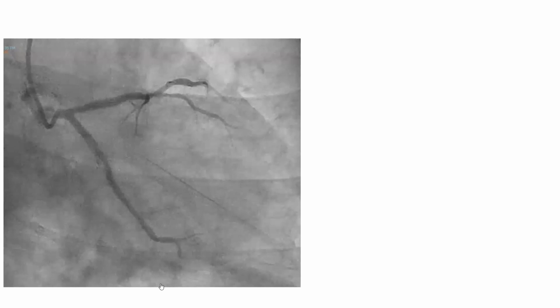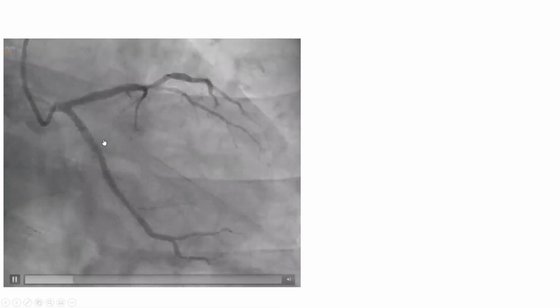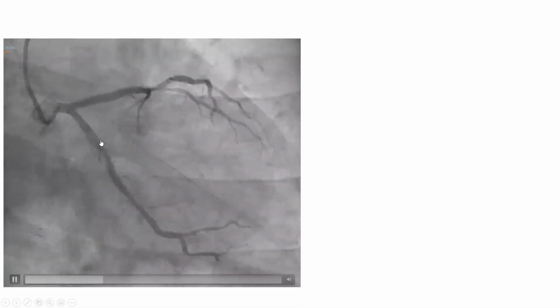I will show you some cases, then I will stop. And I will show a couple more important ideas, including one idea about stent recoil. So this is a 53-year-old man, diabetic. He has extensive history of 3-vessel full metal jacket stenting. He was having progressive angina. It looks like he's having in-stent restenosis of that left circumflex stent placed 3 years ago.